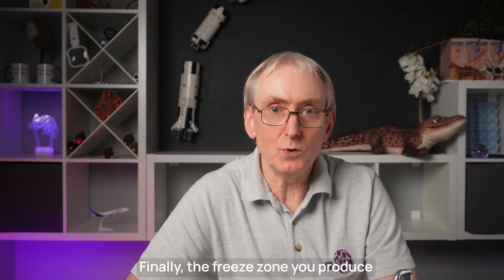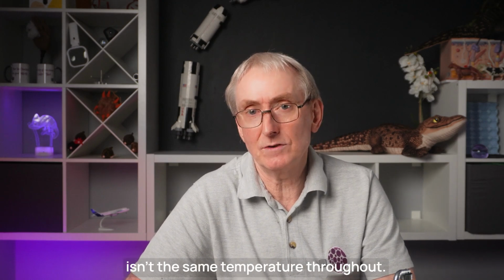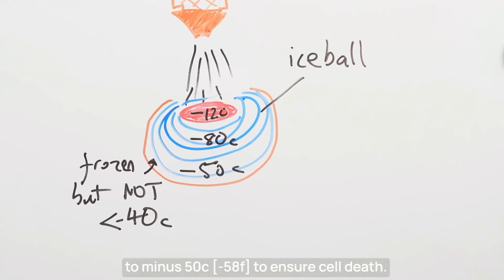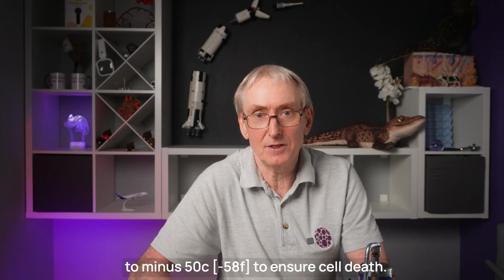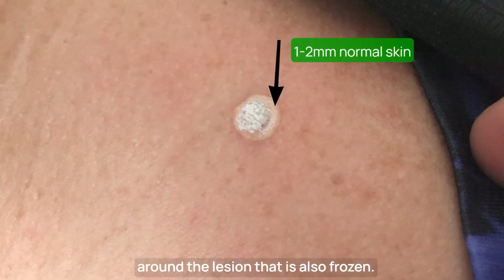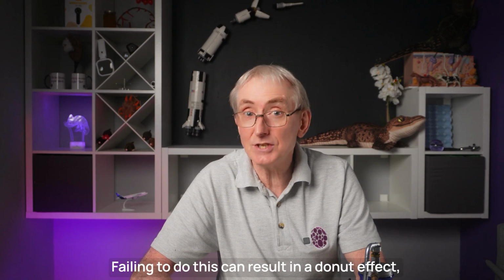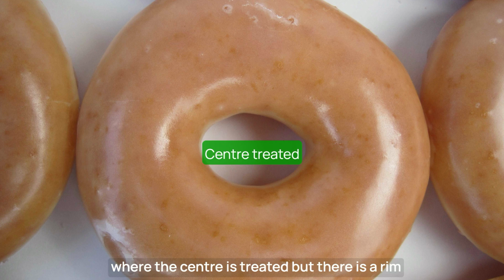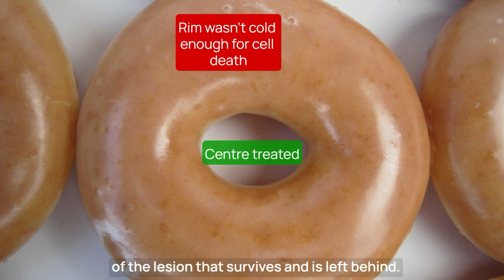Finally, the freeze zone you produce isn't the same temperature throughout. It's dome-shaped with a gradient of temperatures. You need temperatures of minus 40 to minus 50 to ensure cell death. That is why a freeze zone should include a normal margin of skin around the lesion that is also frozen. Failure to do this can result in a donut effect, where the centre is treated but there is a rim of the lesion that survives and is left behind.